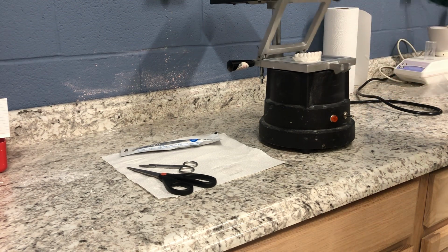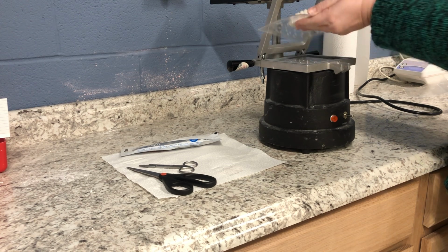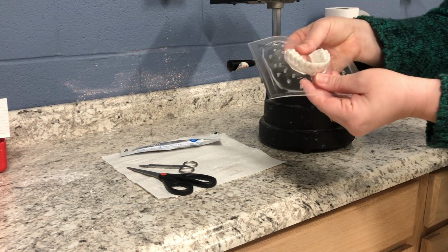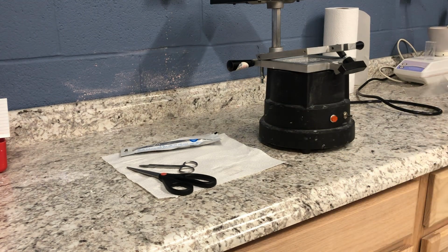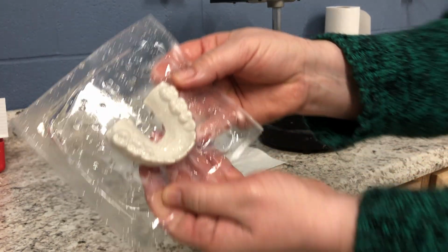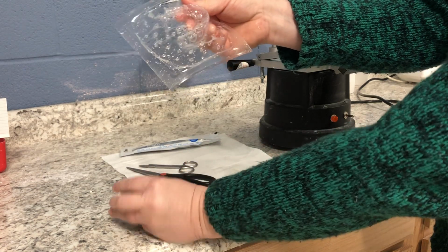So we're just going to raise this up, grab the corner here, and slowly lift up, not pulling anywhere near where the teeth are, because this is still very warm and it's going to warp or distort, and we want it to keep the shape of the teeth. So I'm going to go run this under cold water. And that'll ensure that we have bleaching tray material that's going to stay put, and you'll be able to see that when I take this out, it pops out fairly easily.